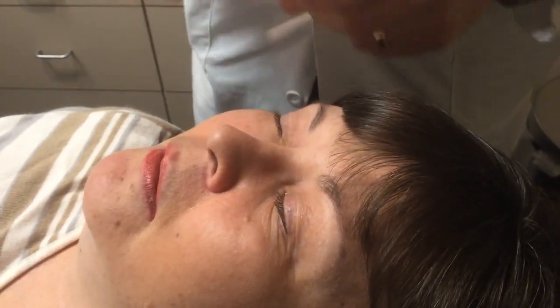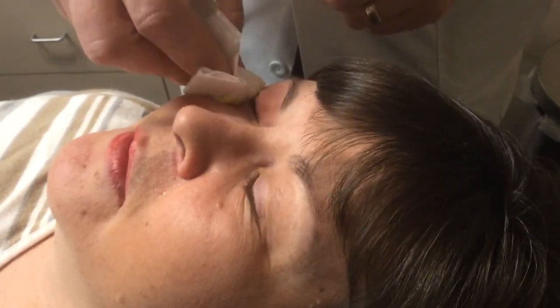That one's going to be a little uncomfortable, okay? Oh, okay. I don't think we've done that before. No, I've never had one of those before.